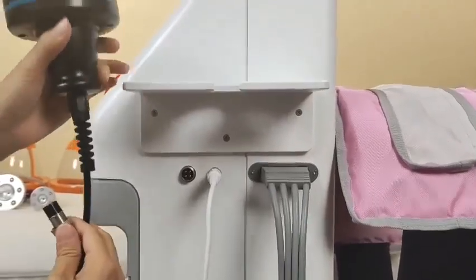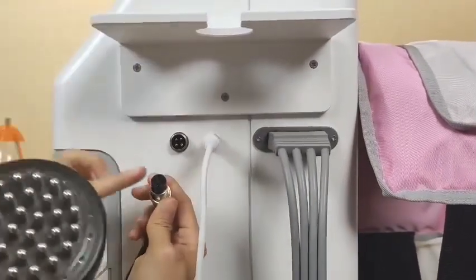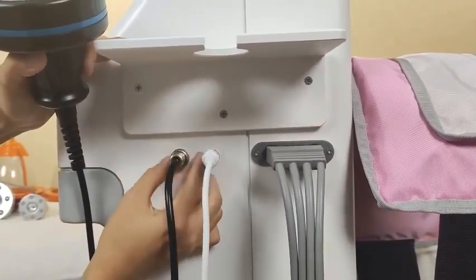This one is the microcurrent brush. The same operation — we just need to match the hole inside, press, and the last step is to tie it.